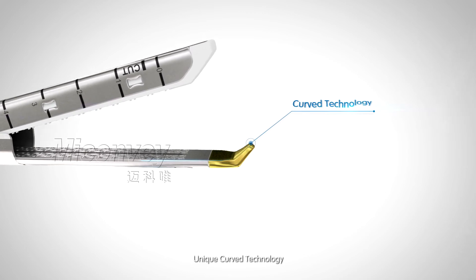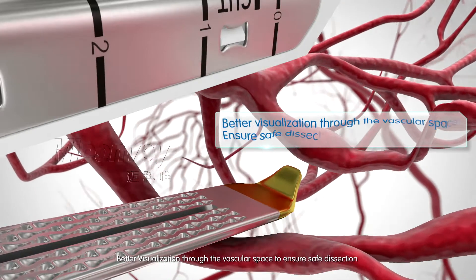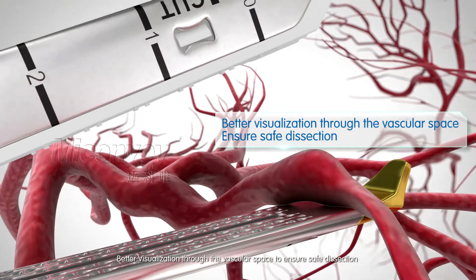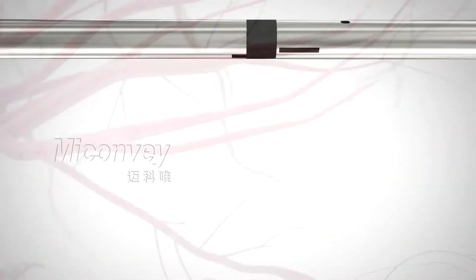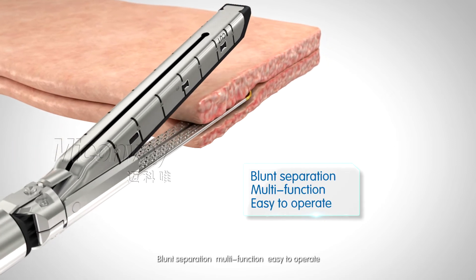Unique Curve Technology. Better visualization through the vascular space to ensure safe dissection. Blunt separation, multi-function, easy to operate.